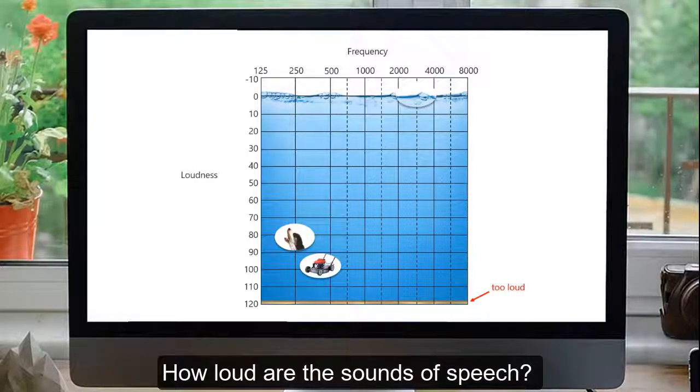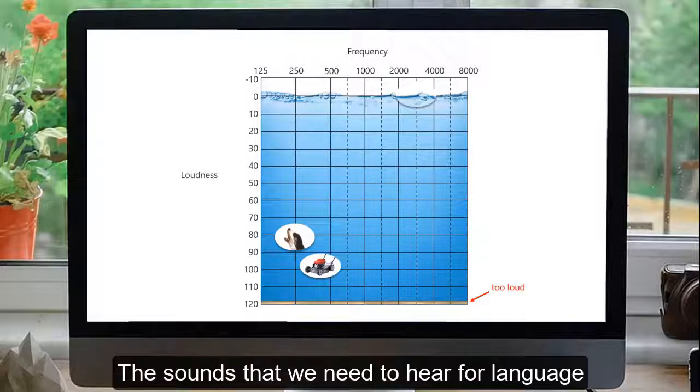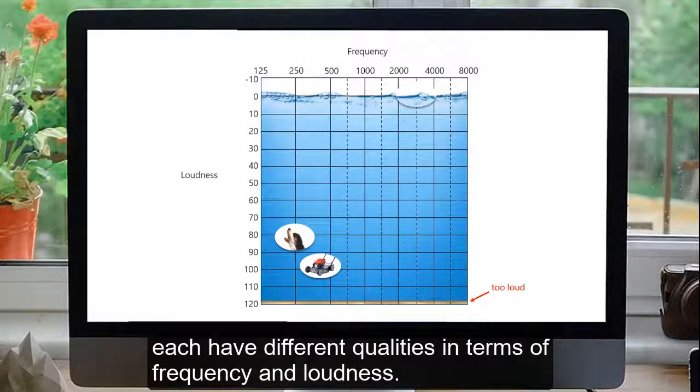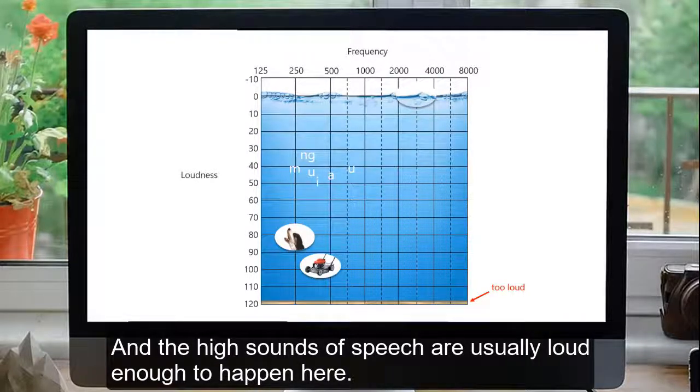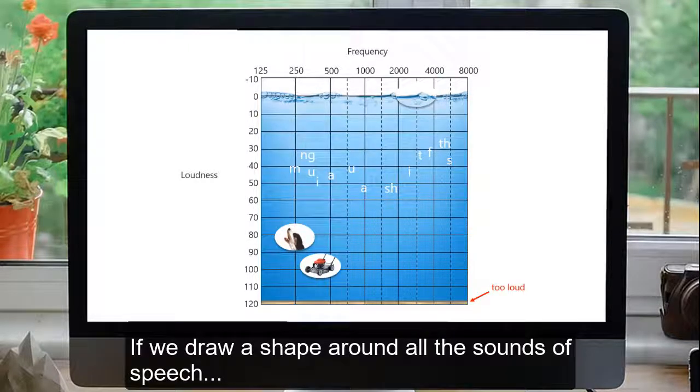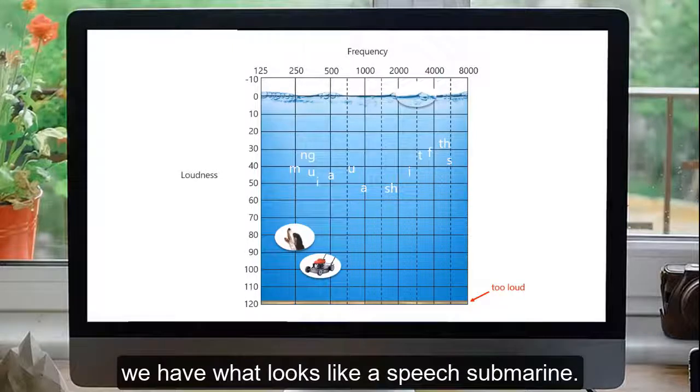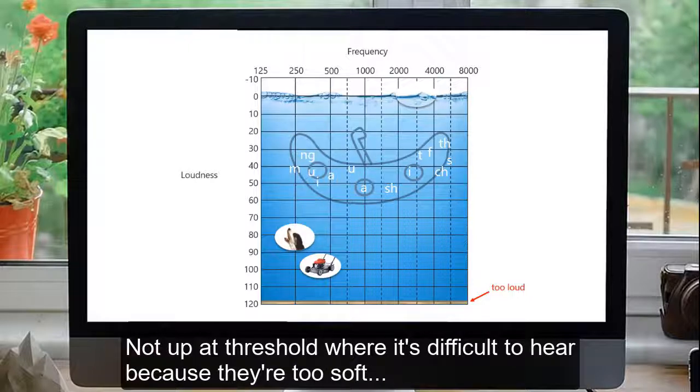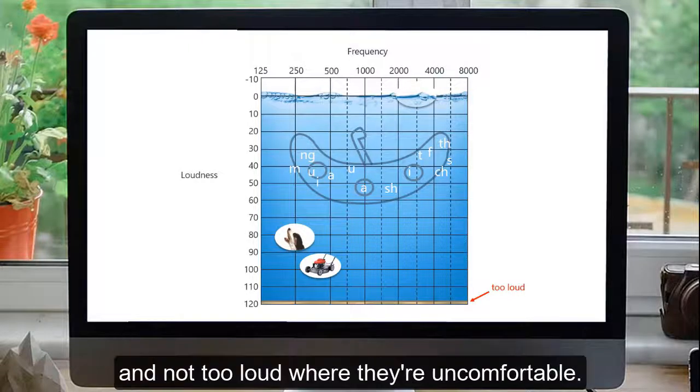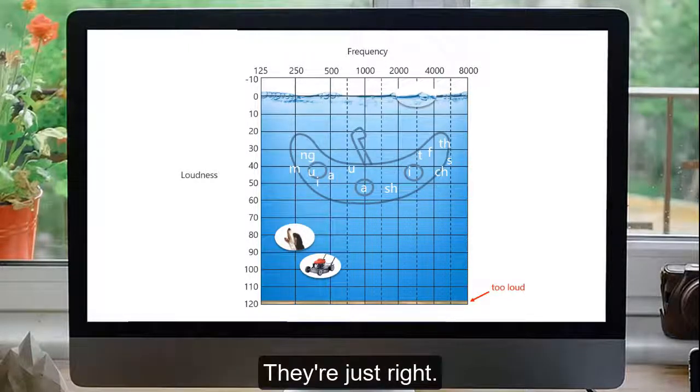How loud are the sounds of speech? The sounds that we need to hear for language each have different qualities in terms of frequency and loudness. The low sounds of speech are usually loud enough to happen here, and the high sounds of speech are usually loud enough to happen here. If we draw a shape around all the sounds of speech, we have what looks like a speech submarine. The sounds of speech are just at the right level for most people to hear easily. Not up at threshold where it's difficult to hear because they're too soft, and not too loud where they're uncomfortable. They're just right.